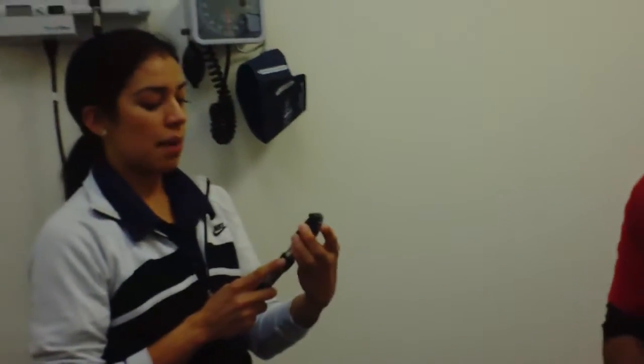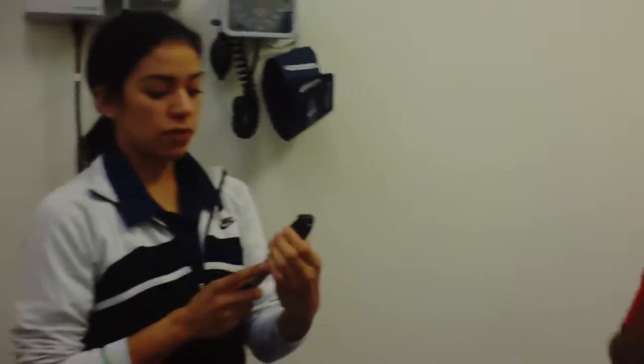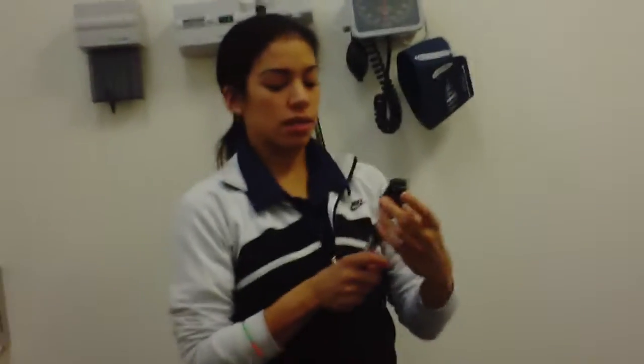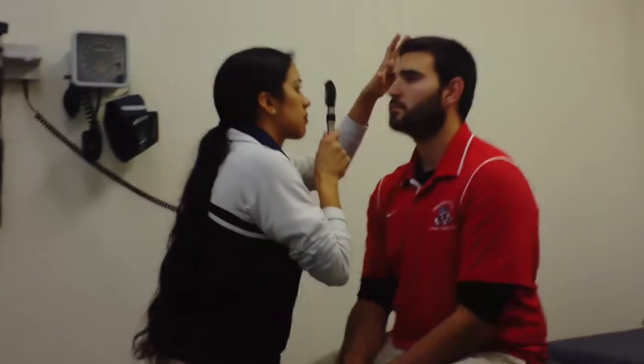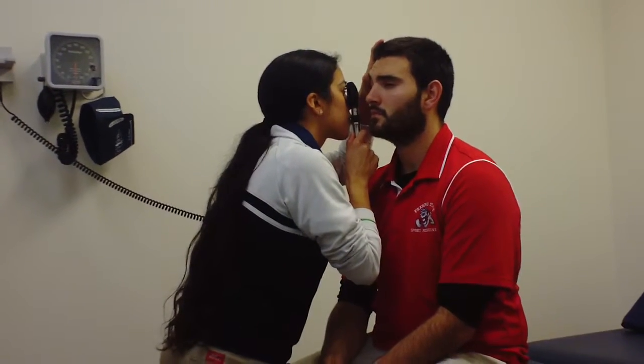Finally, I'm going to be examining the iris. Now with the iris, you want to set the numbers for the short focal length through a range of 15 to 20. So I'm going to use 20 just to get a clear view of his face. Alright. You have a nice hazel looking iris. Alrighty, so that concludes the eye examination.